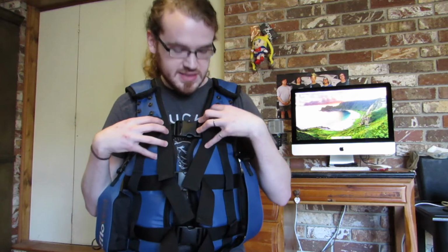That seems to be a varying result with a lot of people. I looked on some forums online, Reddit forums mostly, and it's probably a pretty 50-50 split of people that seem to prefer the Hill-Rom vest to this vest. They say that vest seems to give them a little bit better airway clearance, but that's actually the opposite for me. This vest, if you use the drainage setting, which we'll get into in a moment, seems to personally clear me up a lot more than the Hill-Rom vest ever did.